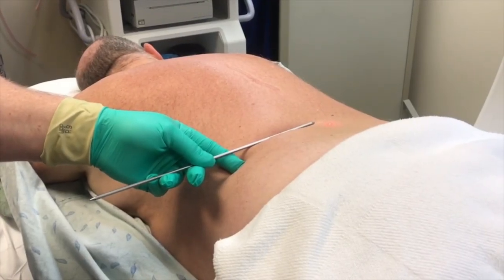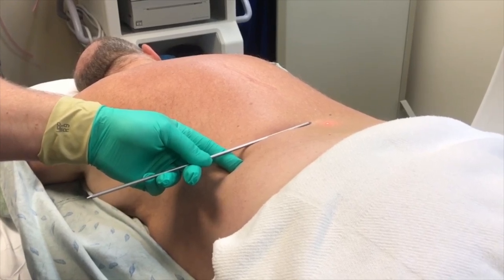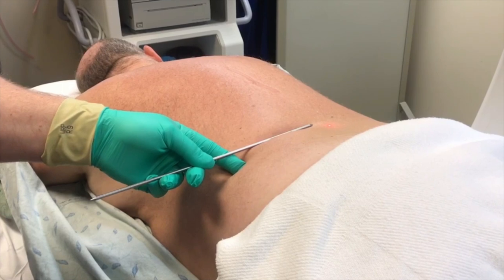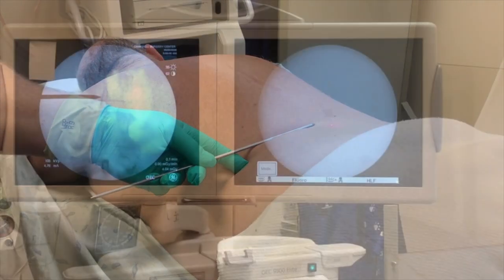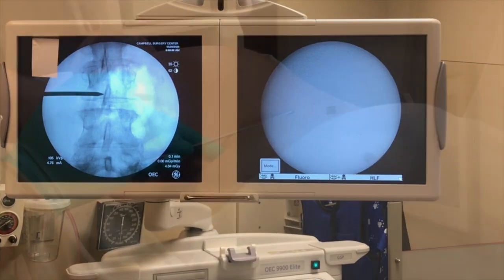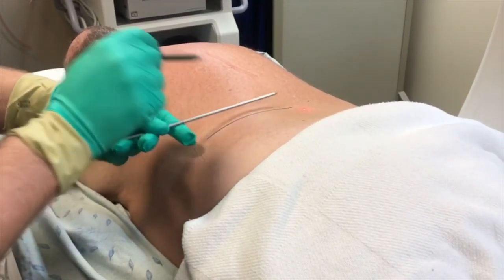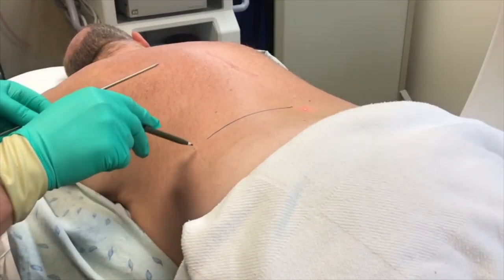With the patient prone, the stick I use is an arthroscopic switching stick. The tip of the stick is midline and it's parallel to the disc. You get this image and you can see on the AP image the tip of the switching stick is in the midline. We just draw that line — we now know that's the midline.